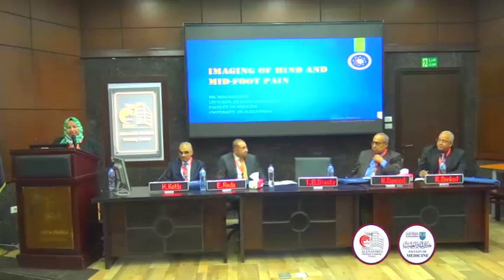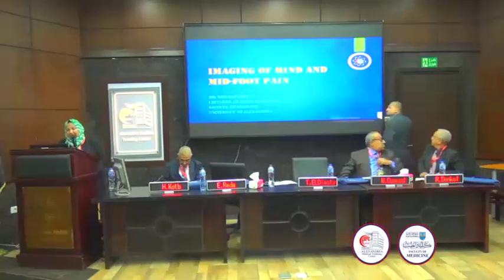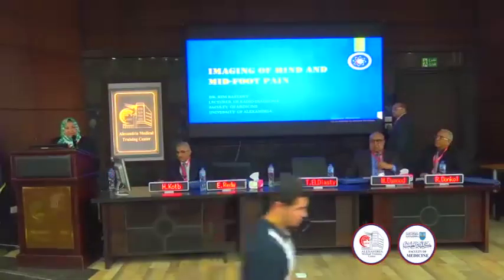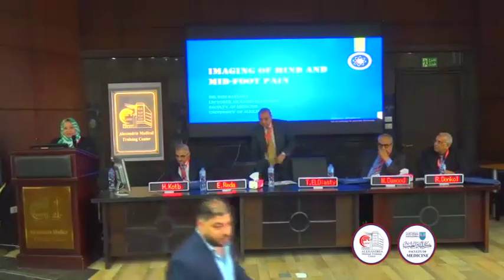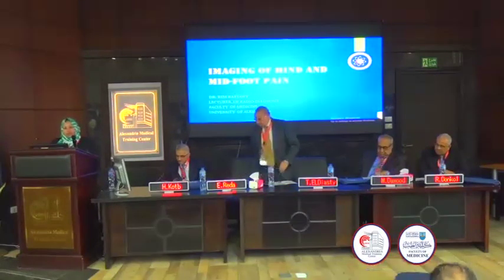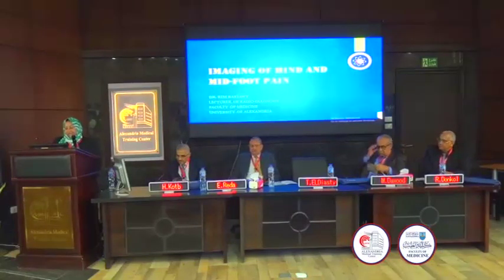Today by giving this brief presentation about imaging of the hind and midfoot. And actually, it's closely related to the previous lecture by Professor Bastawy. There are a lot of subjects which are common between both lectures.